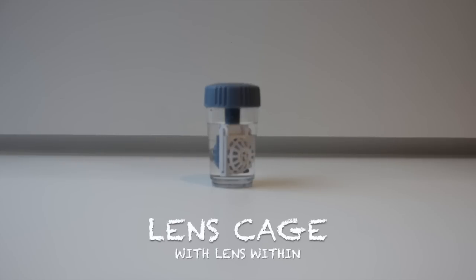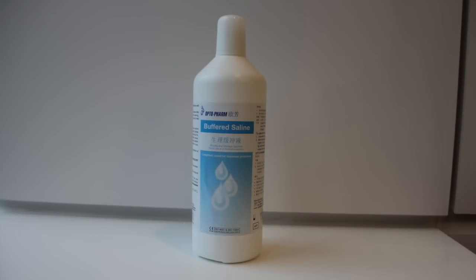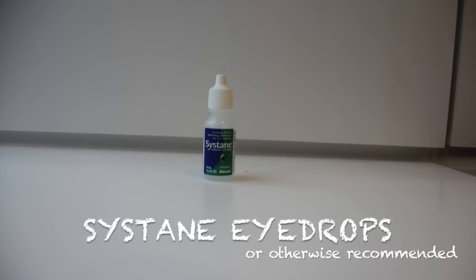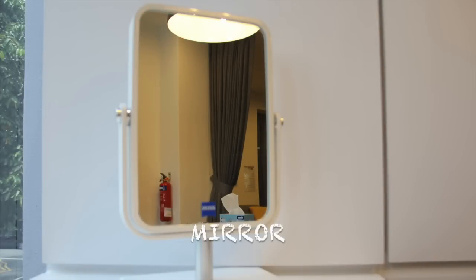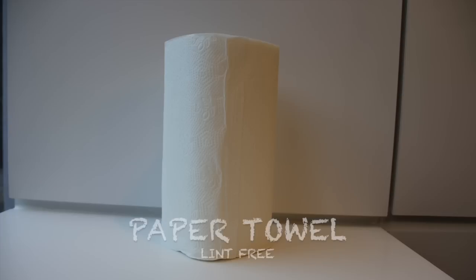Now let's get on with lens insertion. Here are the things that you will need: your lenses, saline, eye drops that have been recommended by your eye care practitioner, a mirror, and some paper towels.